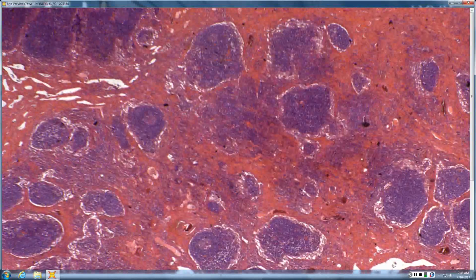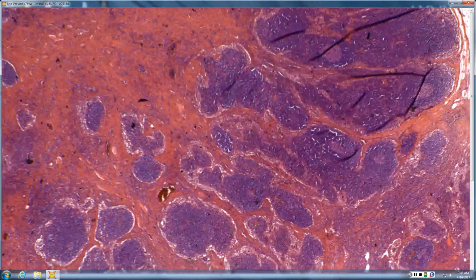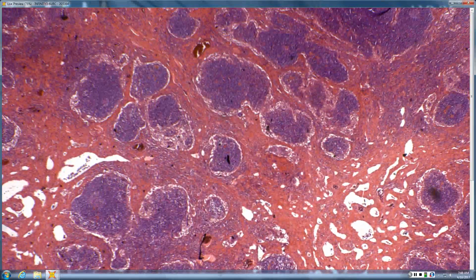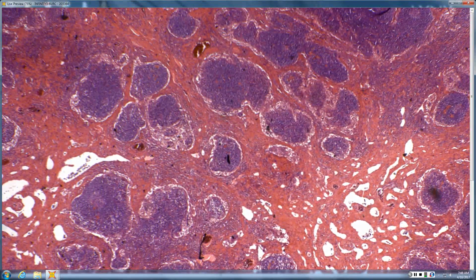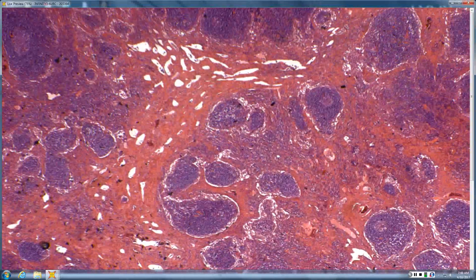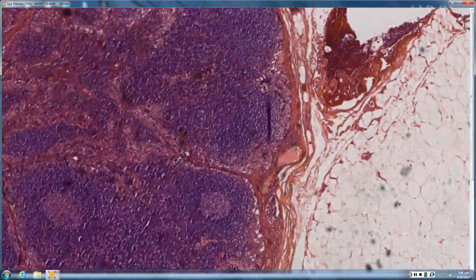Yeah, exactly. So the difference is that ALHE, angiolymphoid hyperplasia with eosinophilia, is an arteriovenous malformation that has a secondary lymphoid infiltrate, whereas Kimura is a primary benign lymphoproliferative disorder that gets some vascular proliferation. And this one, honestly, at scan could be either one. You don't see that big muscular vessel in the center characteristic for ALHE. That really looks like a lymph node. It's got a capsule and sinuses.